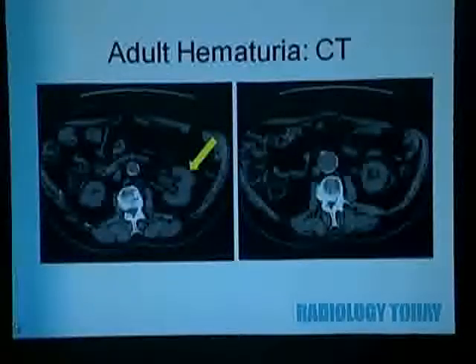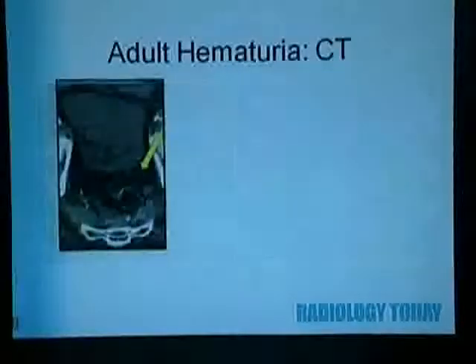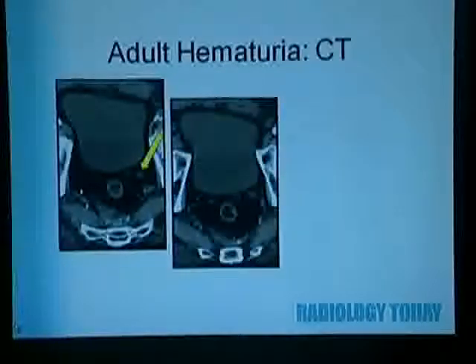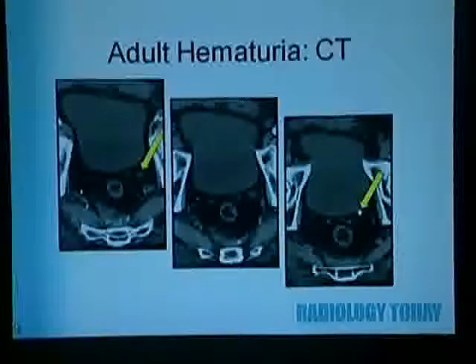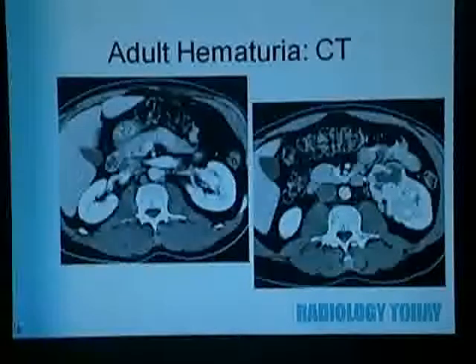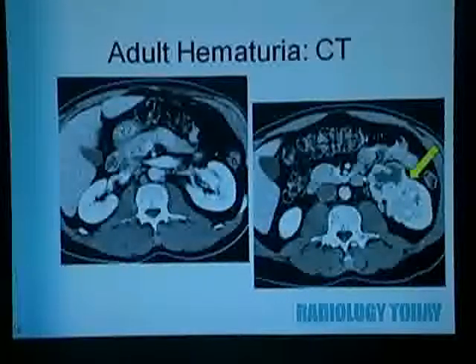So in this particular setting, this patient had unilateral left renal enlargement with ureterectasis. Down lower in the pelvis, you can see that they still have dilation of that left ureter, still dilated all the way down to the level of a calculus. And again, if there was something dependent in the bladder that just happened to fall in that position on a supine CT, that could be confusing. So you can see how the clinical indications and your guys' clinical opinion can drive us to do a more appropriate test.